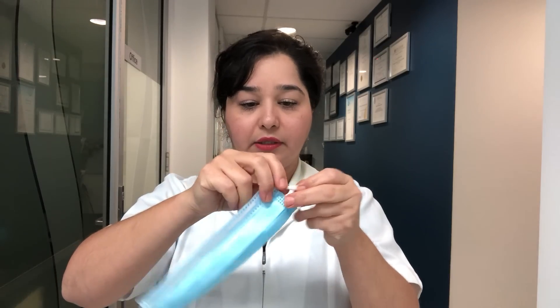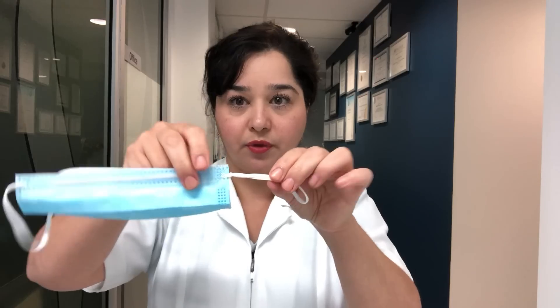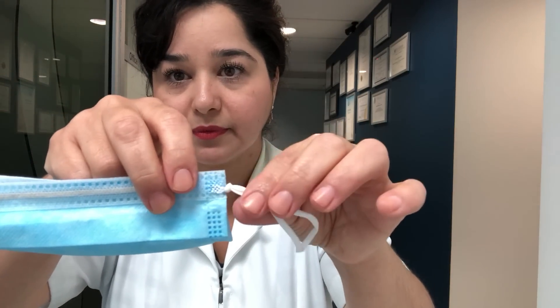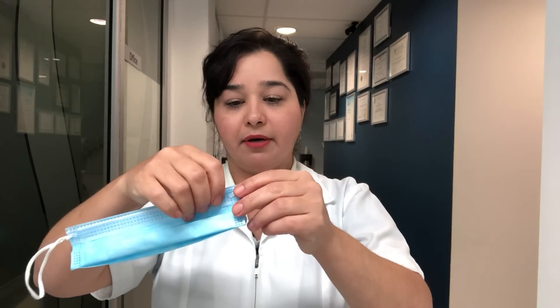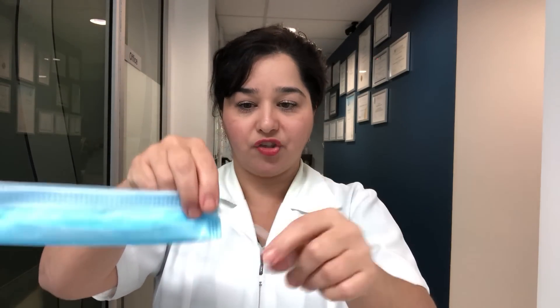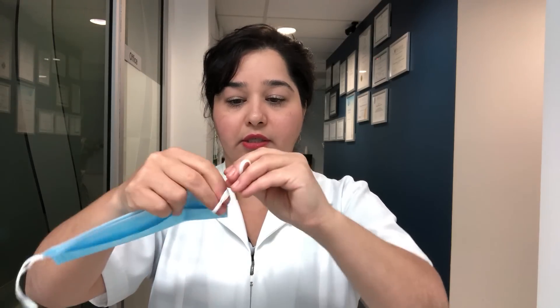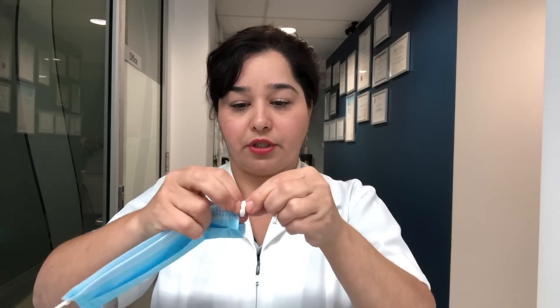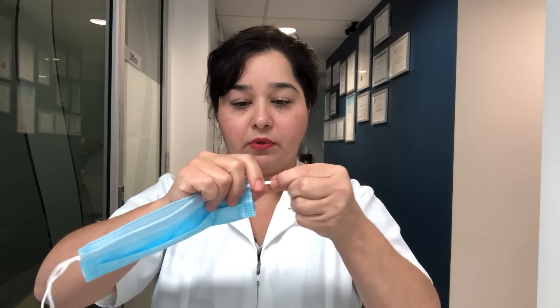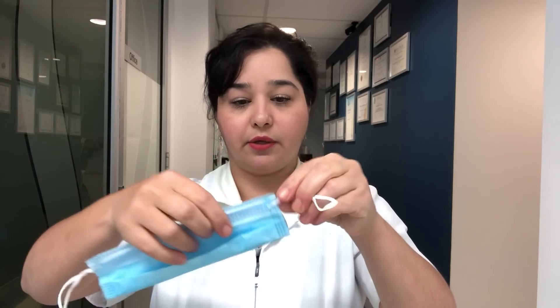It's very important that the knot is nice and close to the end of the mask. Do the same on the other side, making sure that the mask is edge to edge, and when you tie the knot, make sure that it's all the way to the end, nice and close.